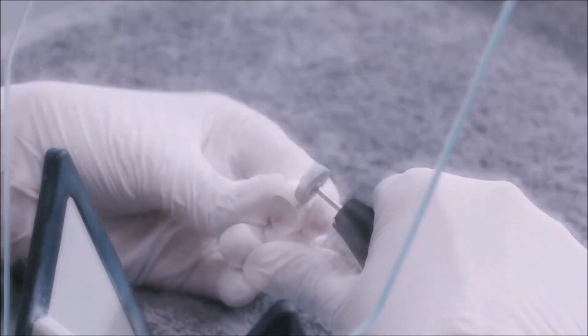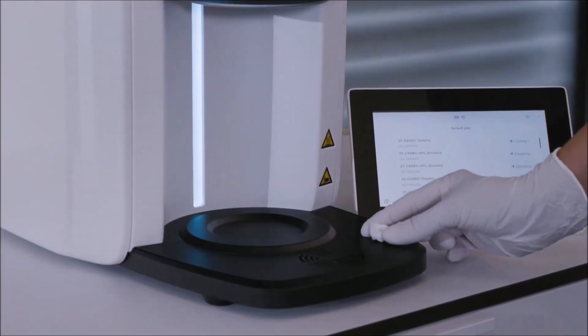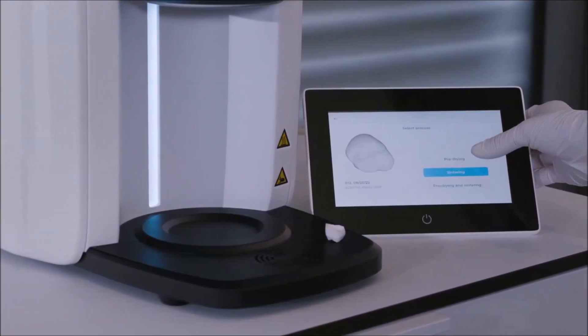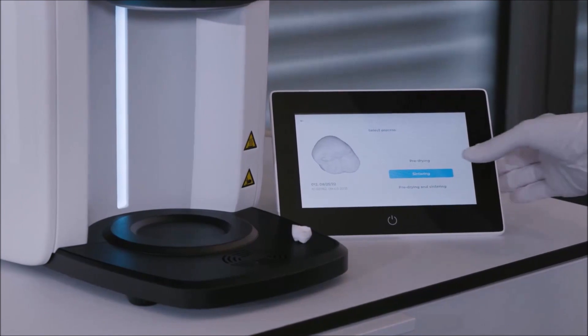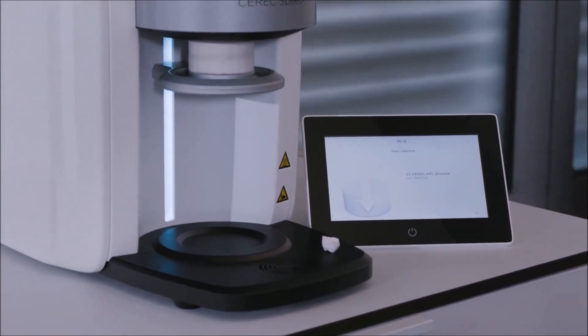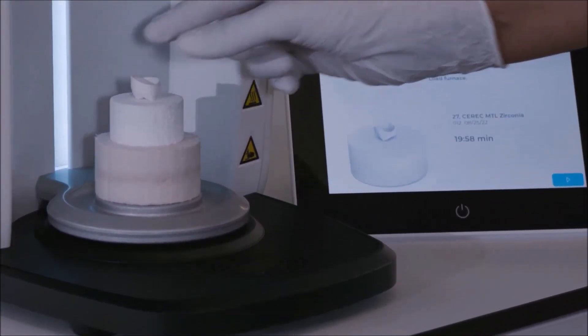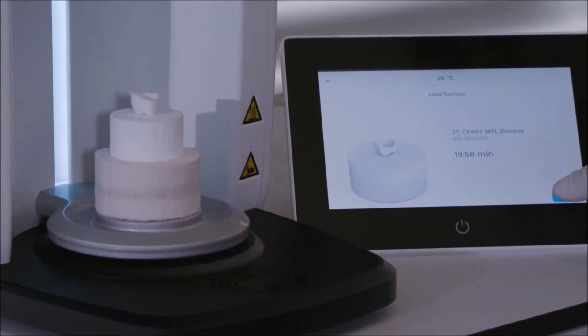While processing, please keep in mind the shrinking factor of CEREC MTL Zirconia during the sintering process. Next, we initiate the CEREC Speedfire sintering program. Once the door has been completely lowered, we place the restoration, without any firing tray, directly on the occlusal surface on the upper door seal, and tap Start.